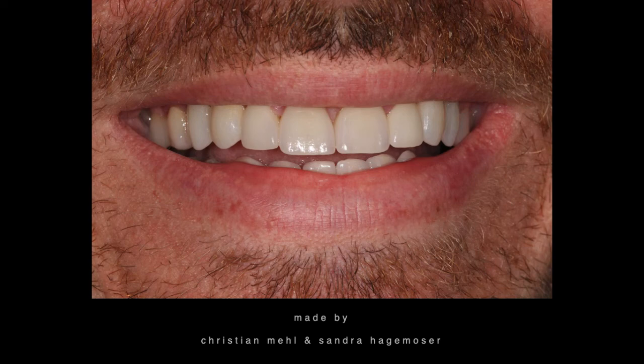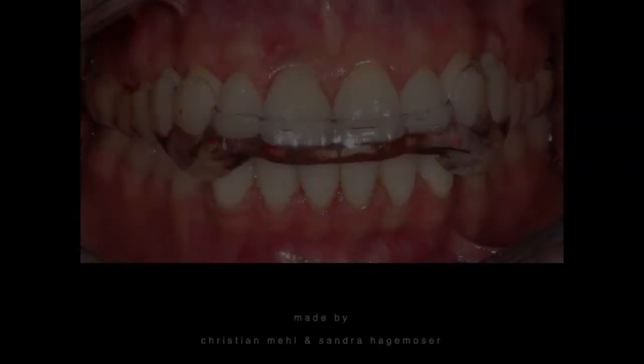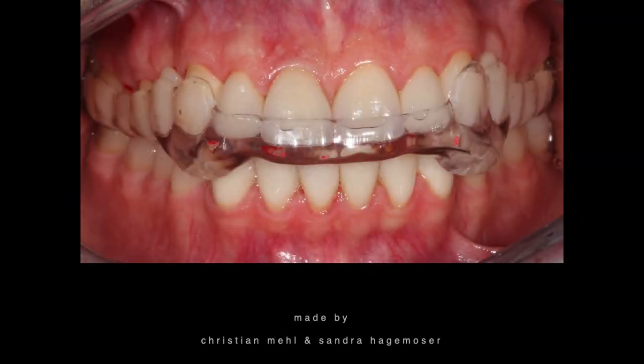Now the patient is completely happy to smile. He has great teeth. Yes, a few things we could have done better. For example, a slightly longer upper right canine, a slightly longer right lateral incisor, and so on. But for the initial work, for just immediately getting it fixed and done, it's not bad. In the upper jaw, from canine to first premolar, we've placed some bridges. In the lower jaw, we just close them with a slightly bigger premolar. And of course, we then in the end placed the Michigan splint just to protect the work.